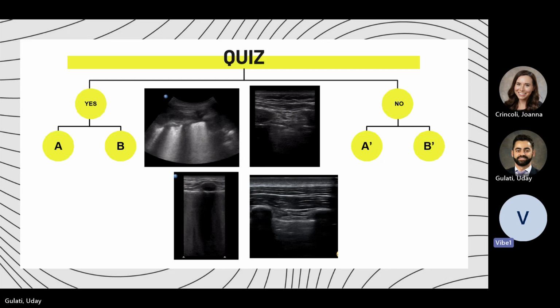There's lung sliding in some areas, but not in all. Yeah, so in this one, in the right upper there is, in the right lower there is. What about the left upper? No. Left lower does not. Left upper, it's hard to tell, it's a little hard to tell for me. Yeah, you kind of see this, right? You kind of see things underneath, right? But that's the pulsation. It looks like cardiac pulsation. Is it? Yeah, so it's your lung pulse.